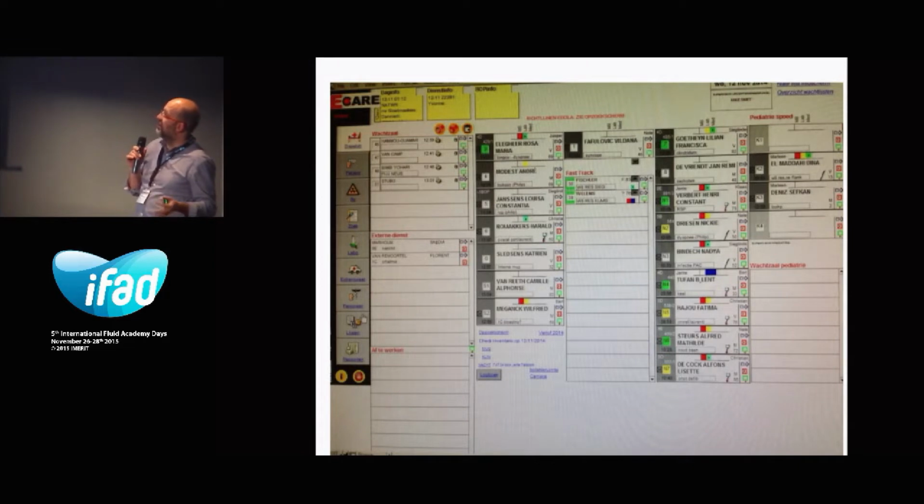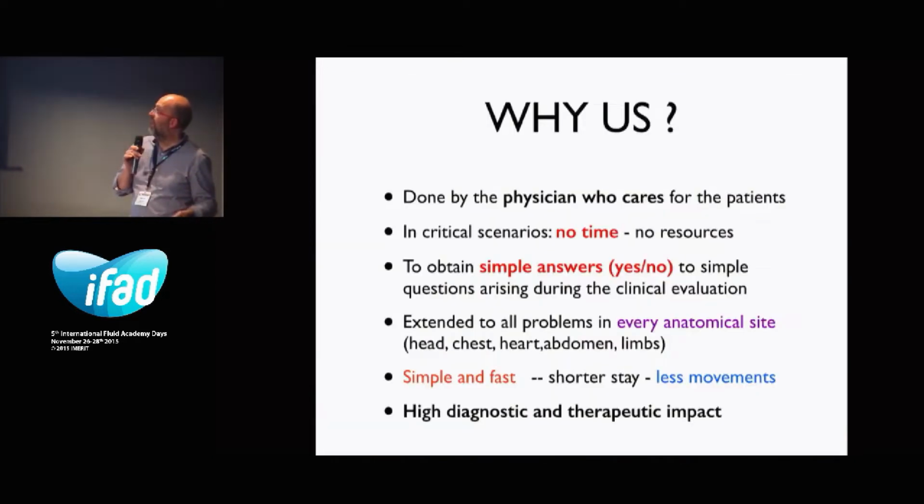So this is an image of the old computer software that we have for our ED. Very busy department sometimes, and then you have to make decisions. What patients go to the CT? What can you do yourself? So why is ultrasound done by the physician who takes care of the patient in critical scenarios? No time, no resources, to obtain very simple answers, yes or no, to simple questions arising during the clinical evaluation.